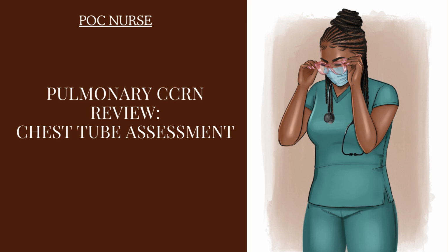If a patient has subcutaneous emphysema and you palpate the area where that subcutaneous emphysema is, it could be around the dressing, you're going to feel like the pop of Rice Krispies. It's going to be like popping under your fingers. You have to let the provider know that this patient has subcutaneous emphysema, because it might represent an air leak inside of the patient.